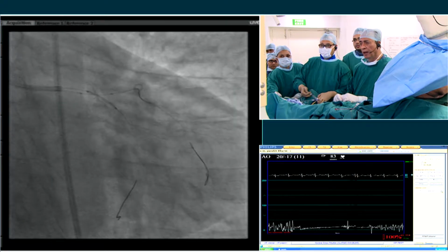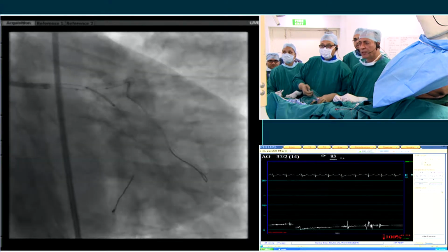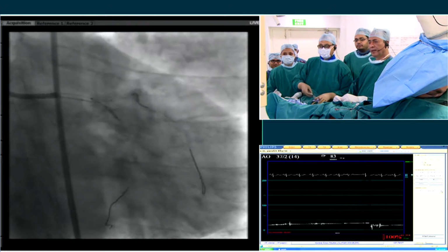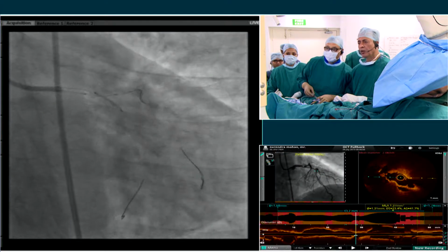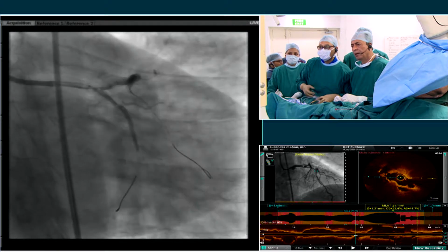Dr. Rath, Dikshit here. Tell me about your case. No, that's okay. But I was just wondering whether the patient has any MR, because the circumflex is occluded. No MR, LV is normal. No RCA MR.